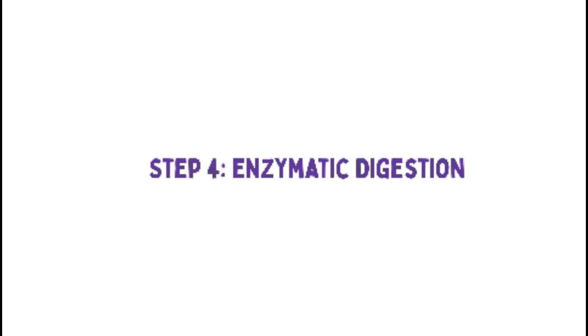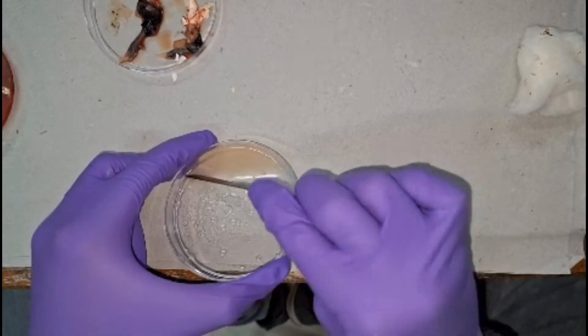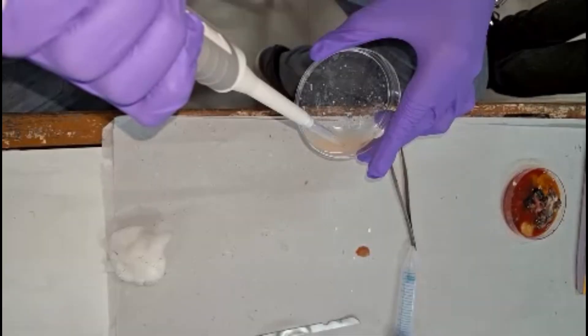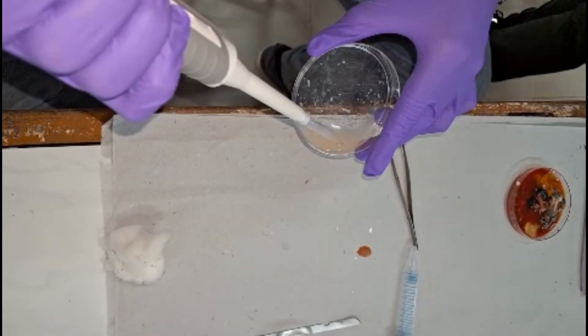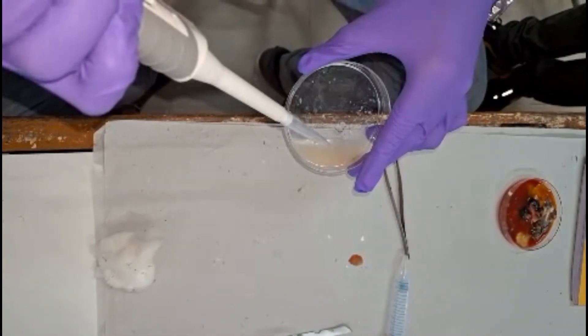Step 4: Minced tissue is incubated with trypsin EDTA solution — in some cases collagenase can also be used — at 37 degrees Celsius for 10 to 15 minutes to break down the extracellular matrix. This allows the fibroblasts to dissociate from the tissue.